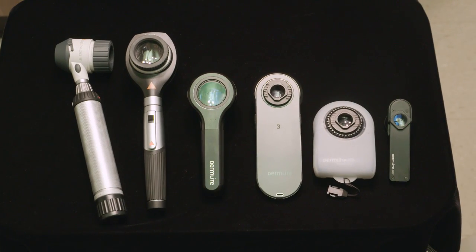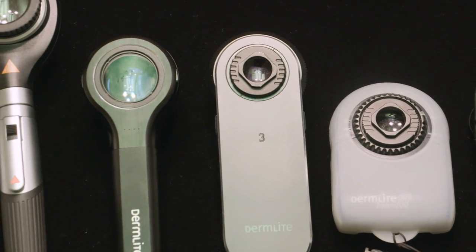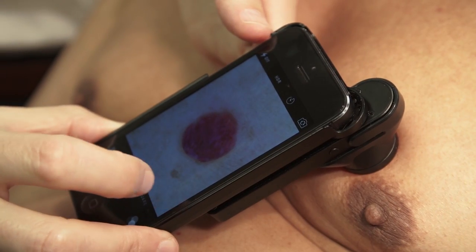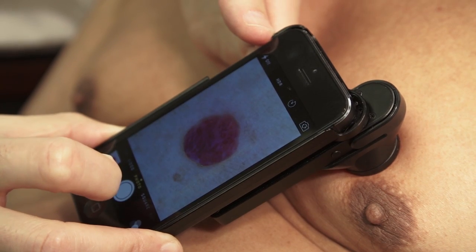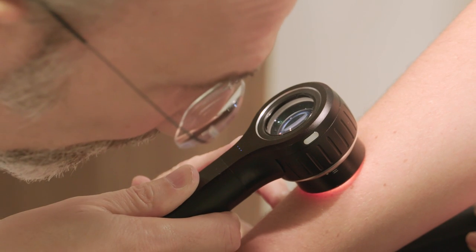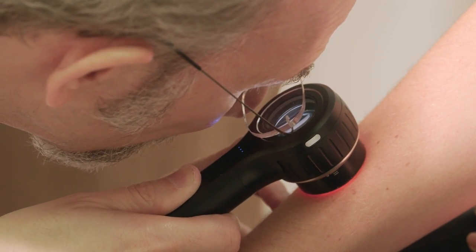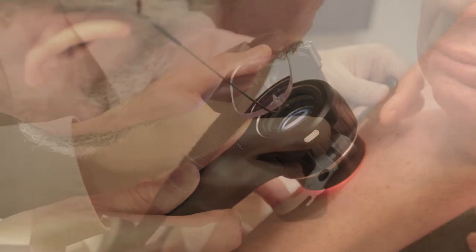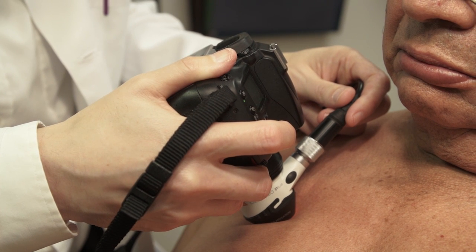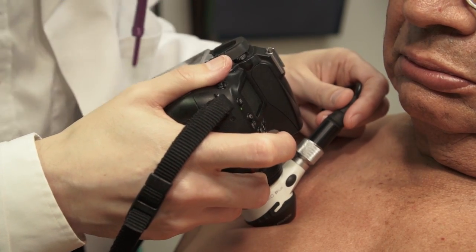There are a number of dermatoscopes available from a small list of companies. They come in all shapes and sizes. The DermLite 1 is attached to an iPhone for visualization of another cherry angioma. The newest DermLite 4 has great optics and a large viewing plate for examination of larger lesions. The viewing plate can be removed for easy cleaning. Dermatoscopes may also be attached to cameras, as in this example of the Heine Delta Dermatoscope attached to a digital SLR.